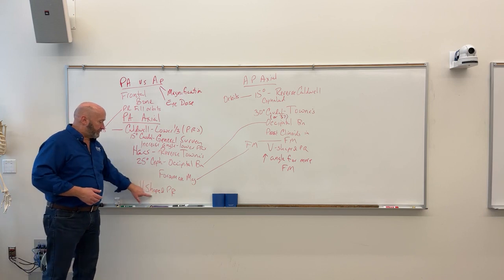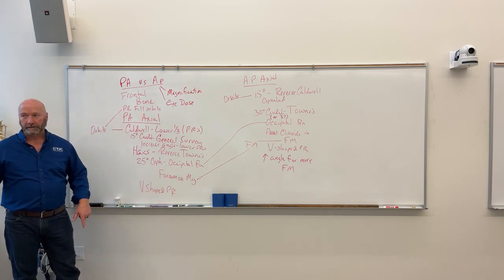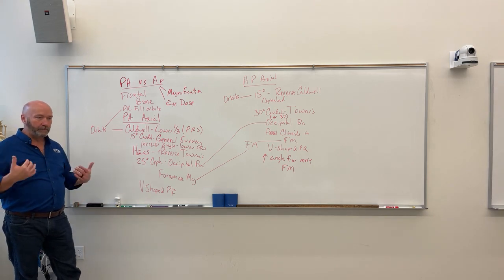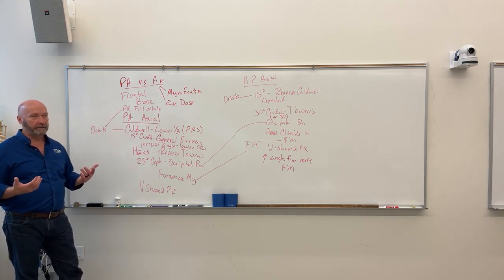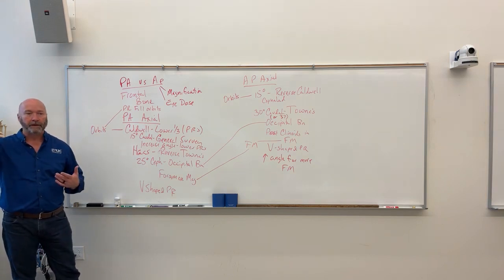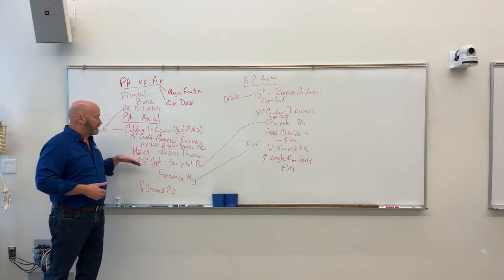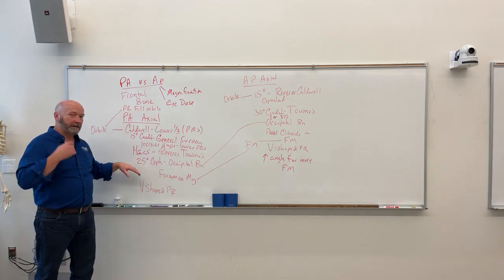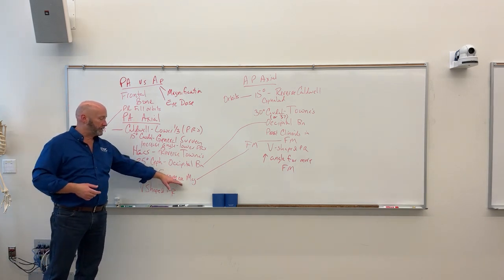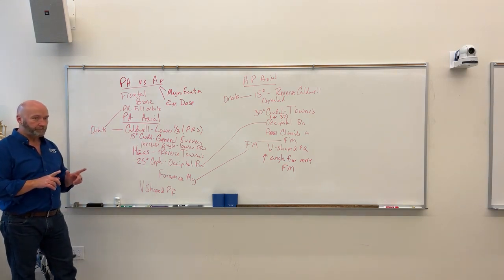But what we're going to see is a V shape of the petrous ridges, right? We're not going to see any orbits at all. The orbits are completely pushed down into the facial bones, or really, I guess the petrous ridges are pushed up above the orbits, is a better way to say it. So the Haas, again, reverse Towns, we're looking for the occipital bone. It's 25-degree cephalic angulation. We're going to see the foramen magnum and a V shape to the petrous ridges, right?